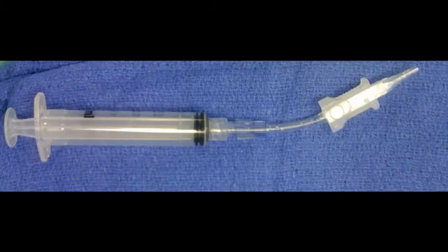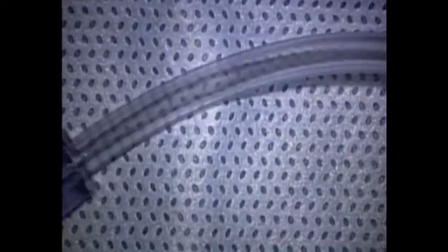Our simple device is constructed using a disposable 10 cc syringe, IV tubing, and an Alcon B cartridge. The IV tubing is cut using drape scissors approximately 2 inches from the hub. We make an effort to make a steep angled bevel. The cut end of the IV tubing is then inserted into the rear of the Alcon B cartridge. The fit is quite snug, and we make an effort to advance the tubing as far as the cartridge will allow.